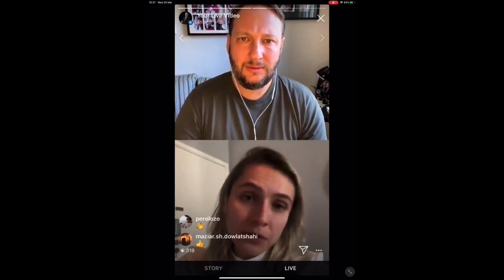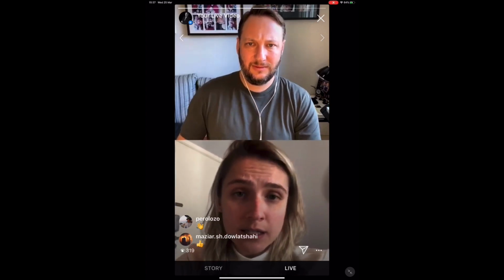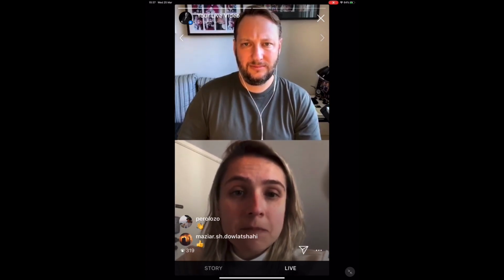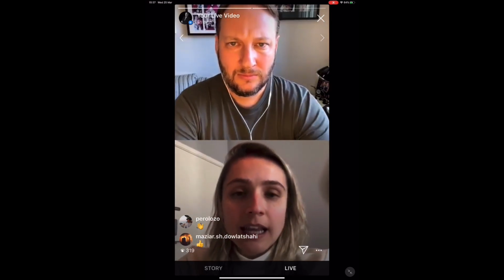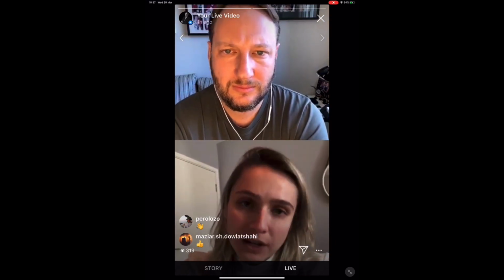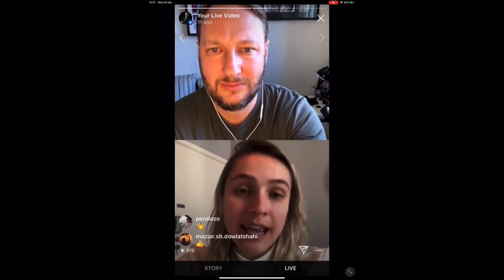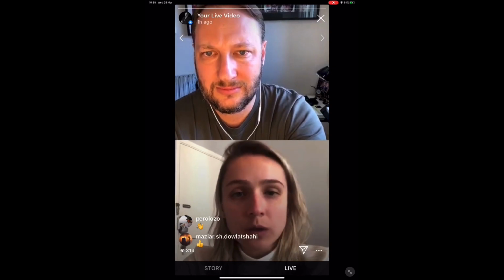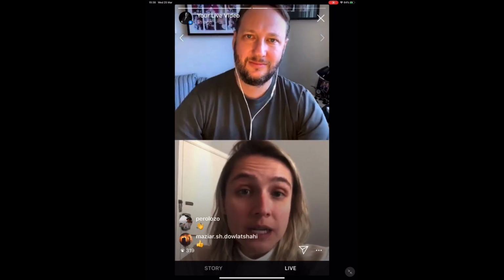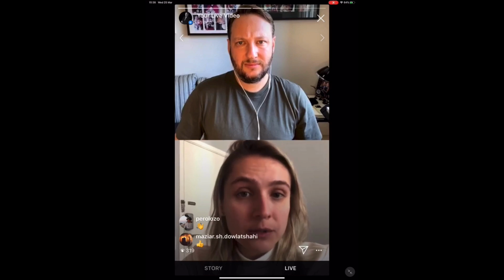So in my experience of presenting those cases, and I'm not an orthodontist, but because I live in an interdisciplinary field, I can show the patient the need, especially now with the 3D technology. And then, showing them with a mock-up the potential of their smile, how they can have a very confident smile at the end of the treatment. For this, they would have to go through 6 or 8 months of ortho. For us, we have a 50% increase in acceptance of ortho using the DSD concepts of planning.